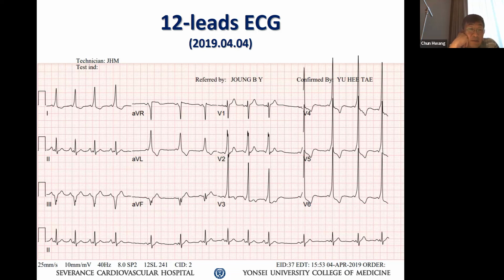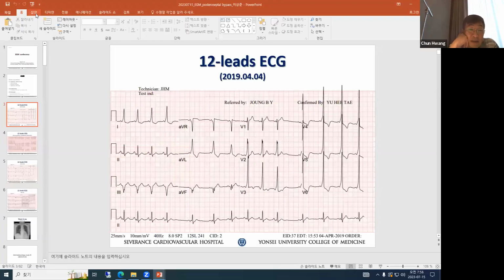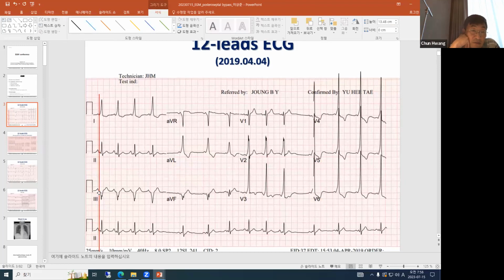Where did the calipers go? Try it. You better learn this now because you're not going to have another chance. I can teach you this. Okay, lead 1, draw the line straight down. Go to the initial onset of delta. Initial onset of delta. Yes. A little more to the left. A little more to the right. Little less. Okay, that's good. Now read it again. So delta is negative in 2, 3, aVF still?